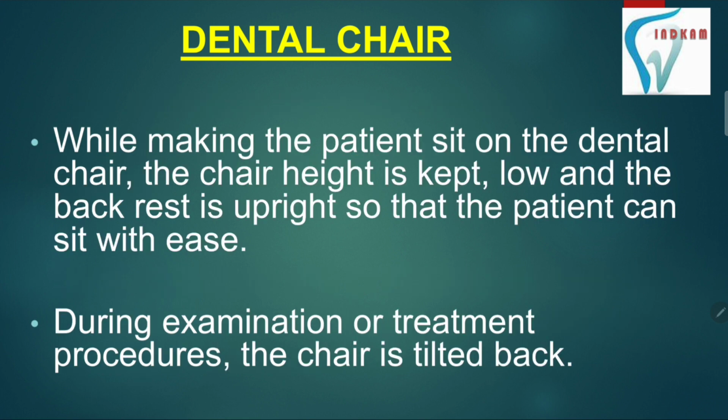While making the patient sit on the dental chair, the chair height is kept low and the backrest is upright so that the patient can sit with ease. And during the examination or treatment procedure, the chair is tilted back.